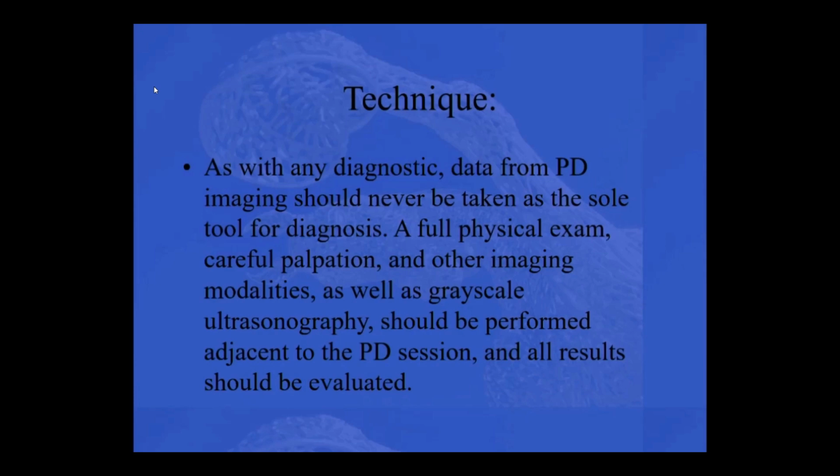Two examples from lectures today where I was thinking I would do power Doppler are, for instance, the patellar ligament, where you get all those changes in structure that we have seen presented today. It's very helpful with power Doppler to look at both structures and see if they have the same blood flow or not. If one of them has much more, you have more an indication there's still something going on there. Same thing with cervical or facet joints. I use power Doppler a lot to get some more additional information, like in a fused joint. Is that normal? Is it not normal? Do I see more blood flow activity around the joint, as an indication for having a problem there?